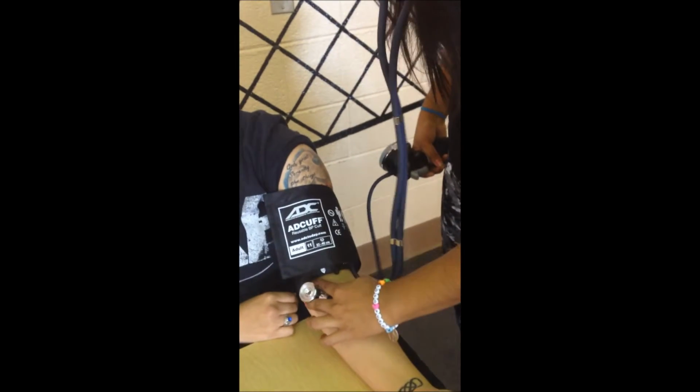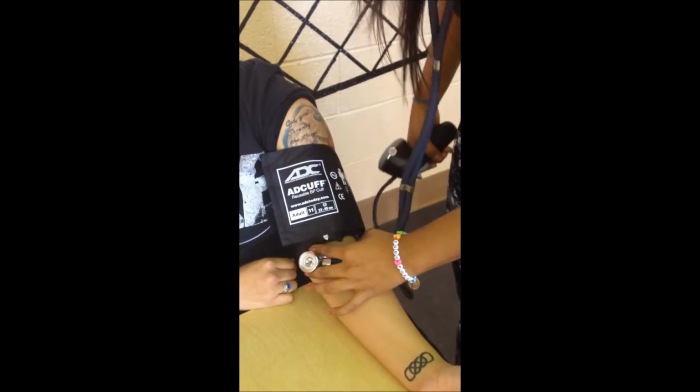Then with the stethoscope, make sure you put it on the brachial artery and hold it like this, because if you put your thumb at the top of the stethoscope, you might listen to your own pulse.